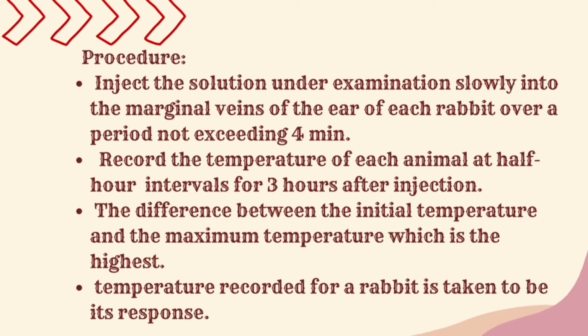Inject the solution under examination slowly into the marginal veins of the ear of each rabbit over a period not exceeding 4 minutes. Record the temperature of each animal at half-hour intervals for 3 hours after injection. The difference between the initial temperature and the maximum temperature, which is the highest temperature recorded for a rabbit, is taken to be its response.